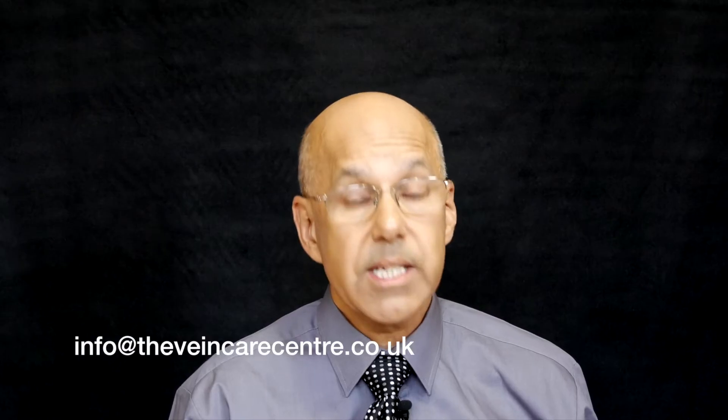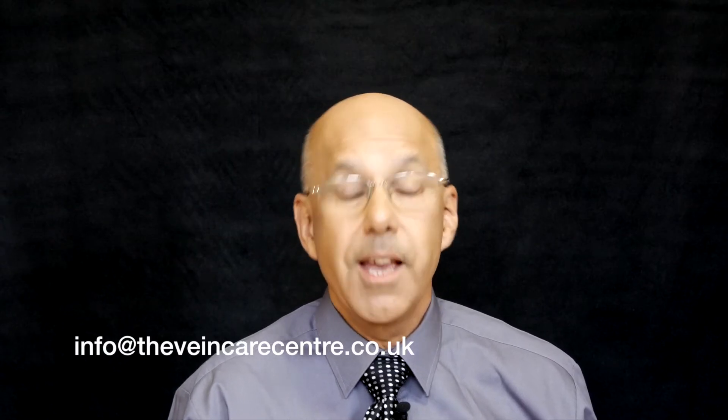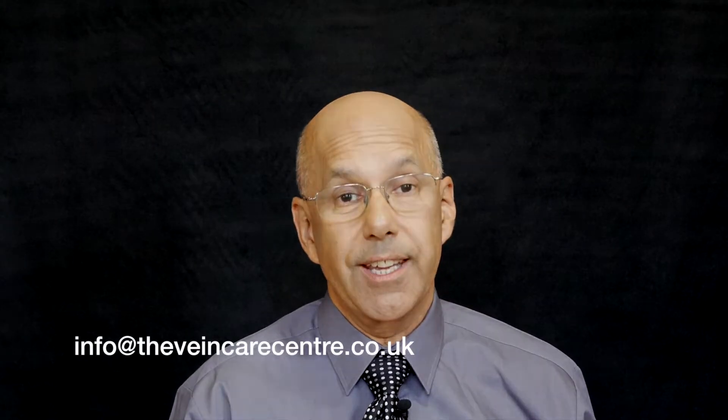Reflux is the most common condition to affect the superficial veins, and in this episode Michelle concentrates on how to examine for superficial venous reflux. If you would like a transcript of this video with explanatory notes, please send an email to the address shown below, repeated at the end of this episode. Please be sure to state which episode notes you wish to receive.